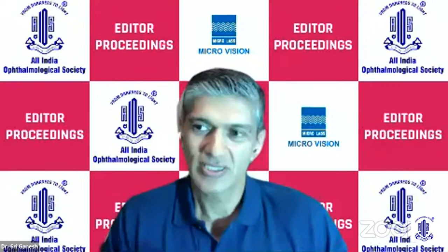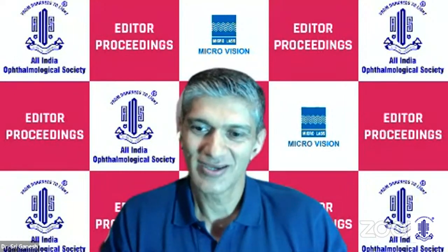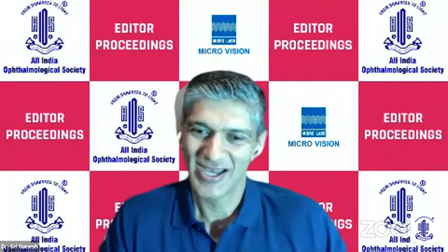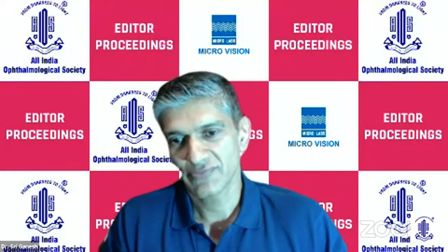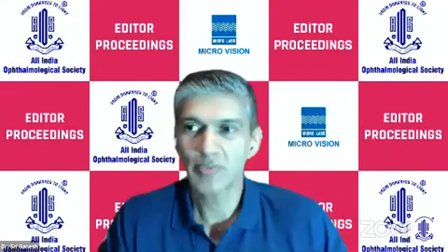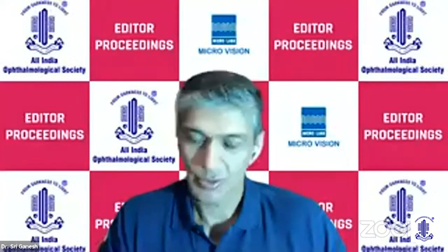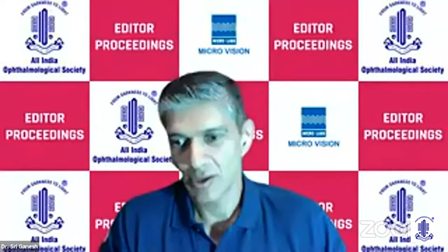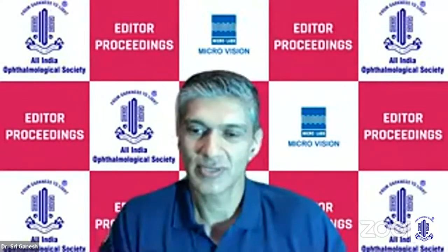So this is a very nice story. I have a lot of biometry stories like this, and this is very important: where you install the biometer, you should look at the environment and see that. So the ocular surface is very important. You can be off by a diopter or two also. So it's very important that you optimize the ocular surface before you take up the patient.